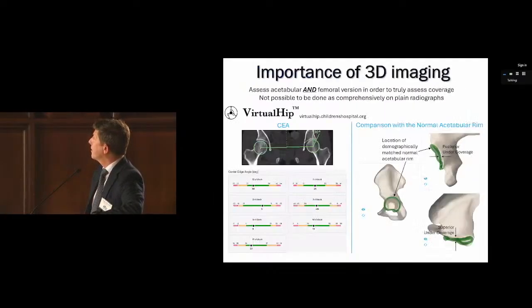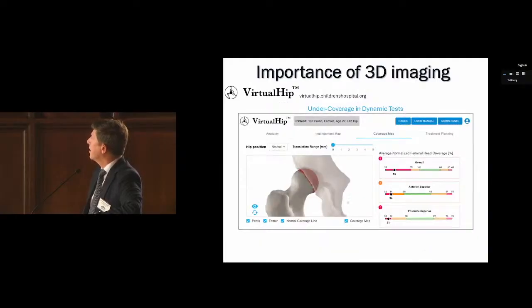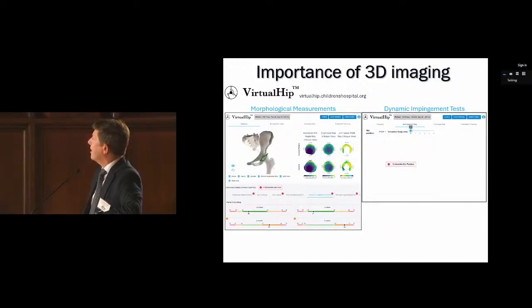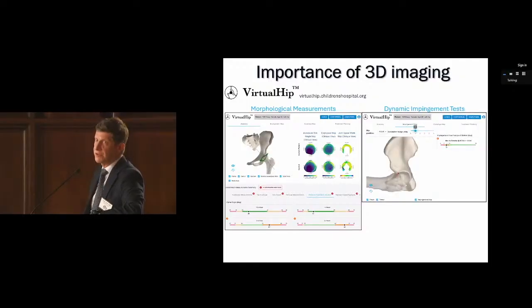This is one of the means, and we've started using this technology more and more. It gives you, again, acetabular and femoral version, much more information than you can get from radiographs. Here it allows you to incorporate some of the translation, as you see here, into defining the level of instability, also in different flexion and extension motions. Here it also gives you, in general, some impingement information. It's also important, obviously, in the peripheral compartment, if you're doing a scope, to address all the pathology there. And here, vacuum sign, so Josh will be happy.